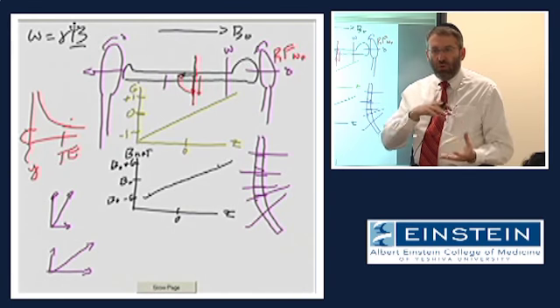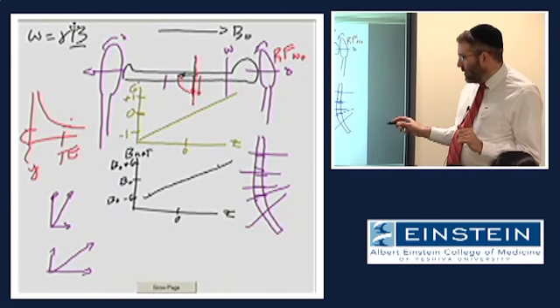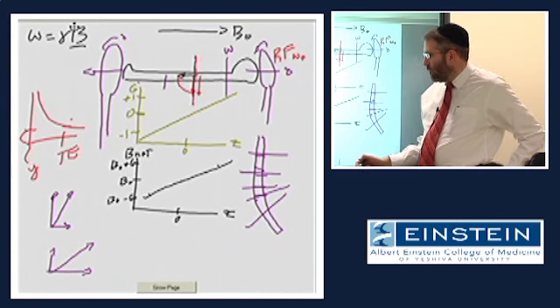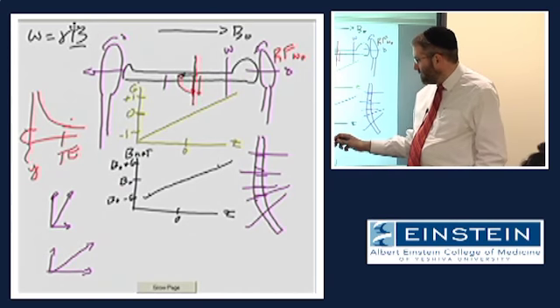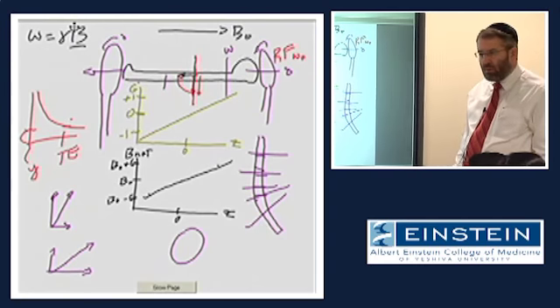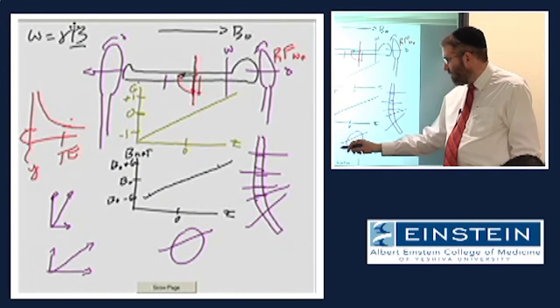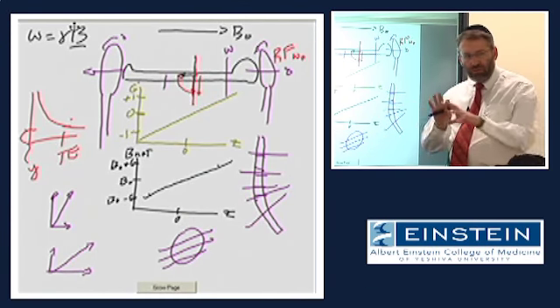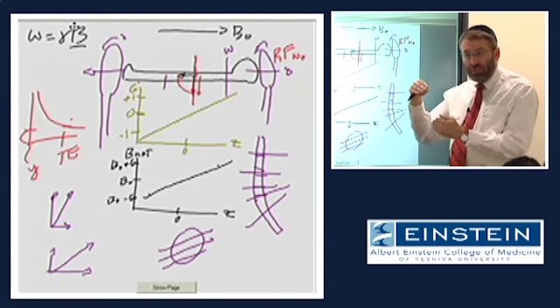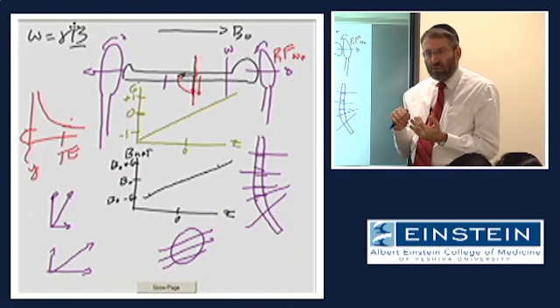So you need to employ all of those gradient magnetic fields. Now, if you actually sit down at the scanner to set up your scan, what you will get is an image after you acquire an image. The scanner will allow you to take a bunch of lines in this graphical user interface and drag them across the scout image you've obtained, for example, and position them in whatever way you want.